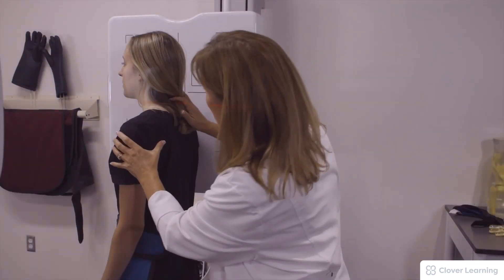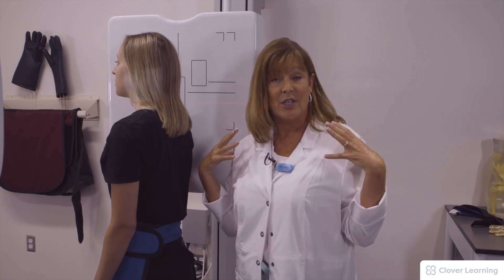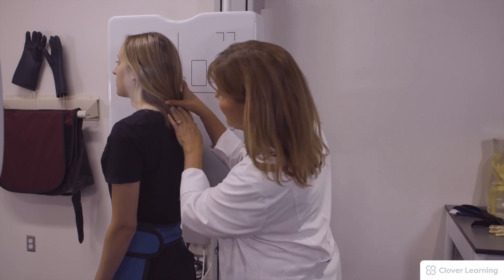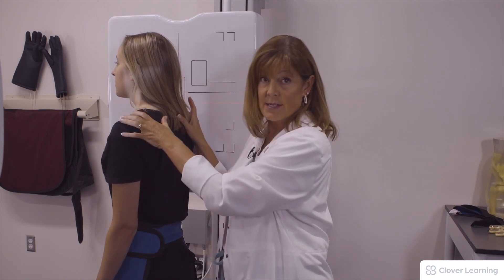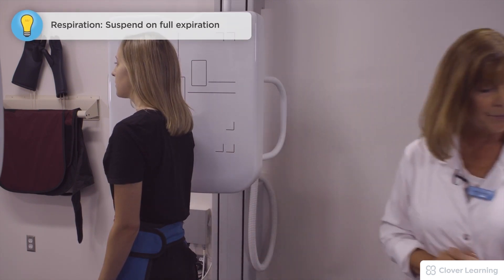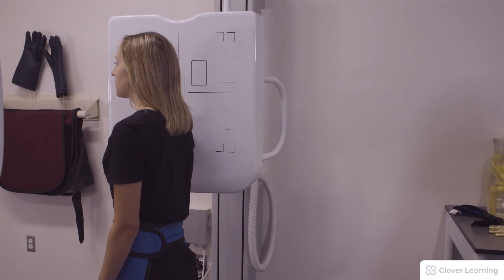It's a good idea to have the patient depress their shoulders so we can visualize C7. We are centered in the coronal plane at C4 with the right marker in front, a 72 inch SID, and a perpendicular central ray. The patient holds very still and the exposure is made.